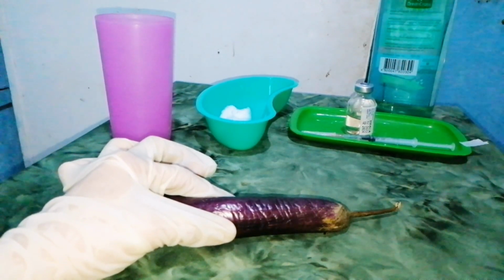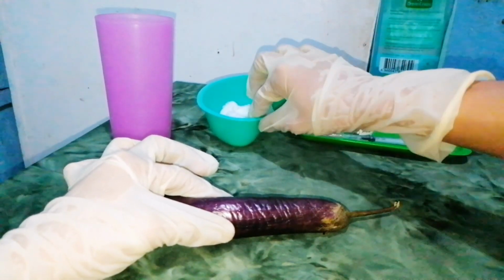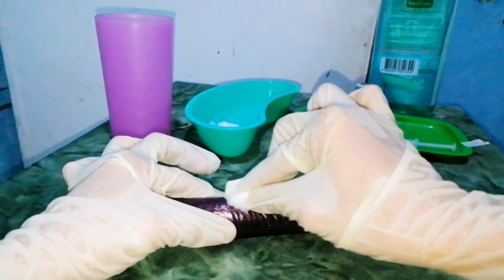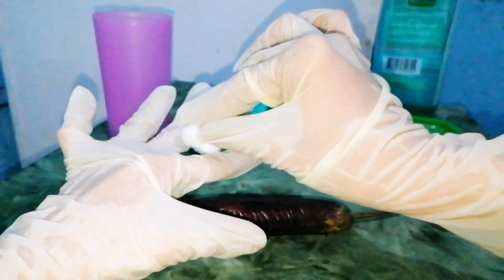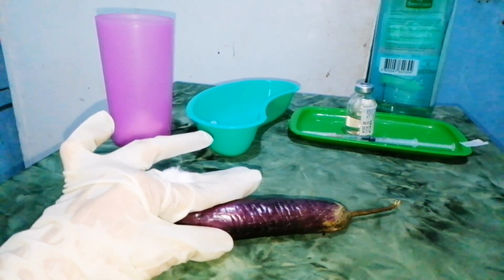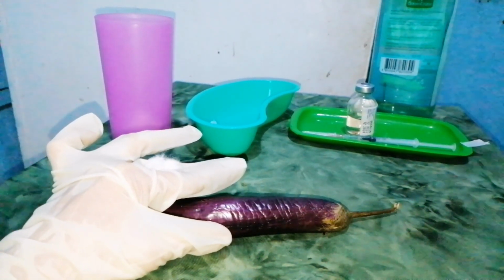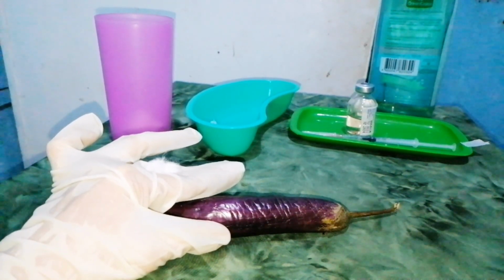Place and hold the swab between the third and fourth fingers of the non-dominant hand, or position the swab on the client's skin above the intended site. And discard the cotton ball. Now prepare the syringe for injection. Remove the needle cap while waiting for the antiseptic to dry, and pull the cap straight off to avoid contaminating the needle with the outside edge of the cap.